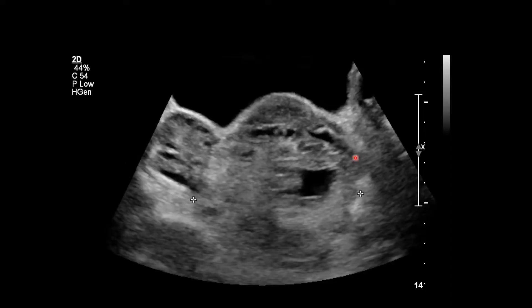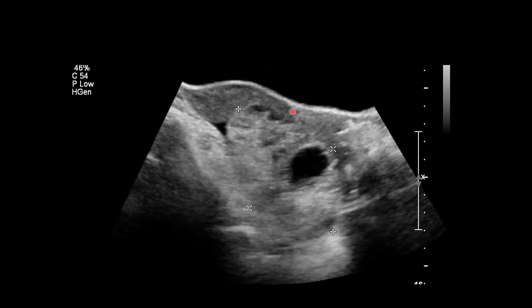Notice how the left ovary is very enlarged and heterogeneous, nearly nine centimeters in size compared to that right ovary. It's located posterior to the uterus. On the sagittal view, we're seeing again the enlarged heterogeneous ovary with some adjacent free fluid posterior to the uterus, and there's the urinary bladder.